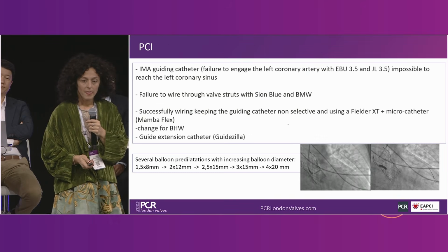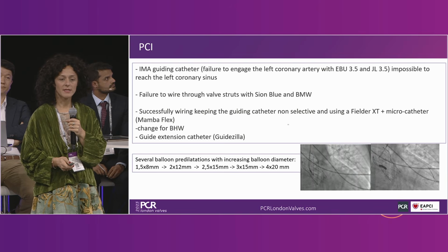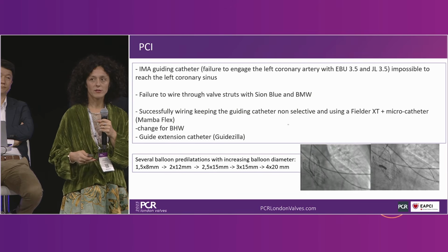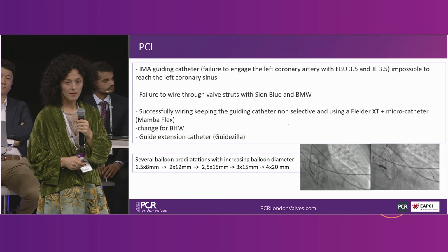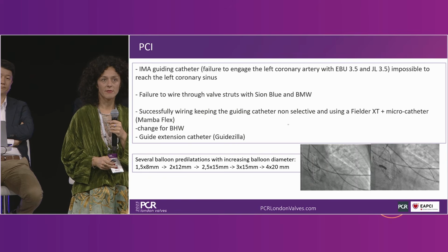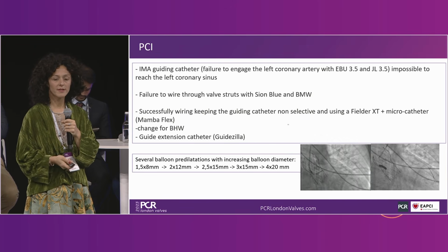Luckily, we were at 3 p.m. and not at 3 a.m., so several operators were present in the cath lab that day, and it was a really serious situation. We put on all the inotropic support and tried to engage the left coronary artery with several guiding catheters, and we could achieve just a non-selective injection with the mammary catheter. We had a lot of trouble passing the struts with the wire and wiring the LAD.